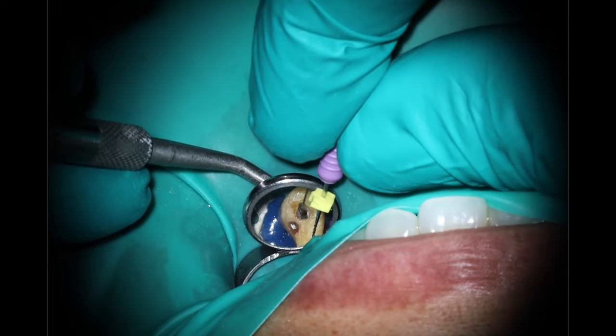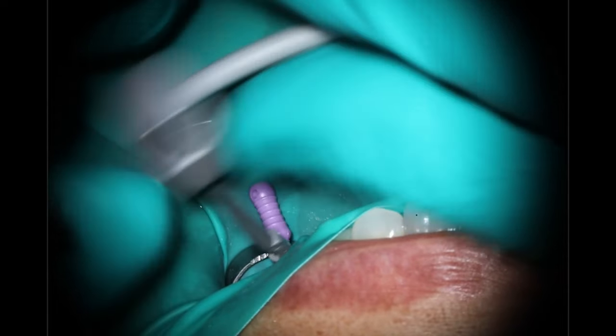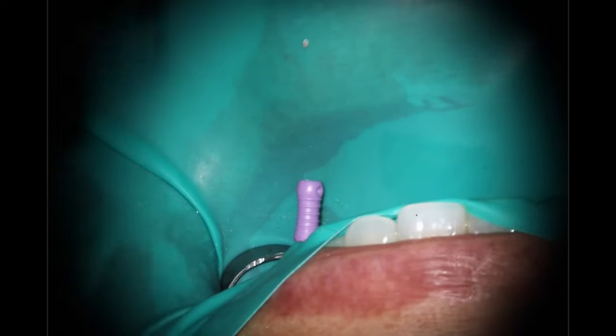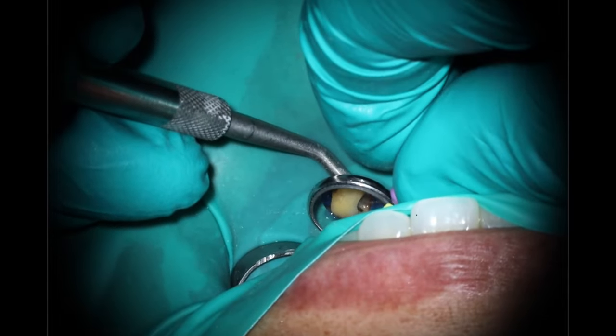Going ahead and getting my length here. As you can see, I like to put that curve on the file — especially because if you look at that pre-op x-ray, there was a decent hook to that mesial buccal root. Getting down there and I'm able to get this most of the way to where I want it — happy with that. But you'll see in a second, I do have to do a little more work than I normally would for that mesial buccal. Only reading about 17 there and I had estimated about 20 for the length.